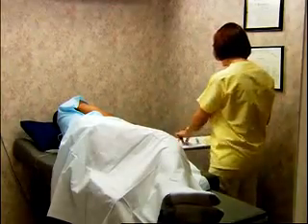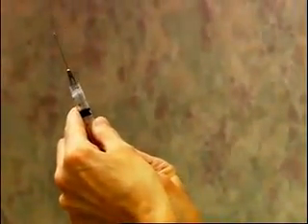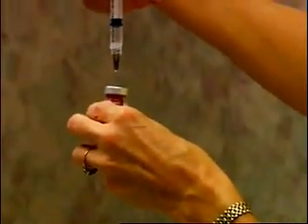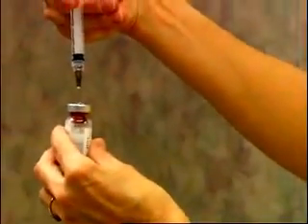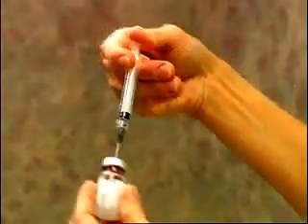Remove the cap from the needle and draw a volume of air into the syringe that is equal to the volume of medication to be withdrawn. Insert the needle through the rubber top of the vial and inject the air into the airspace in the vial, not into the solution, to avoid creating bubbles.